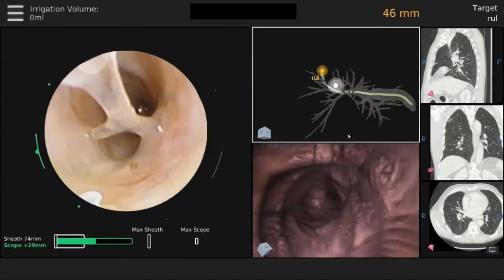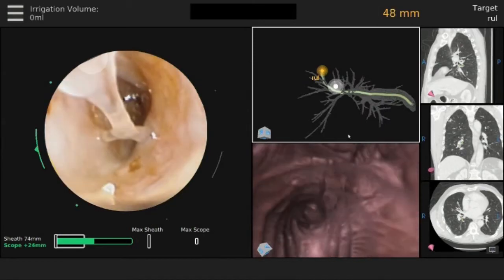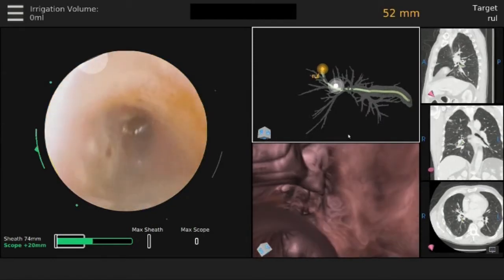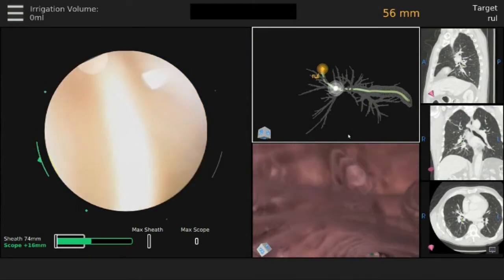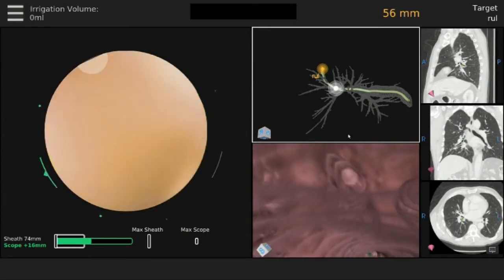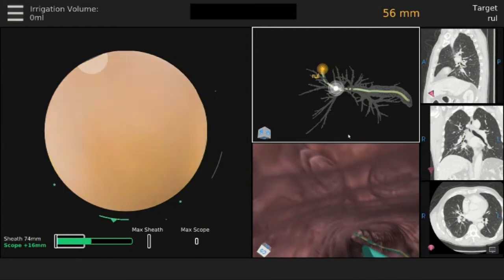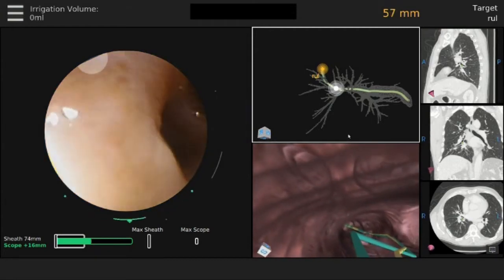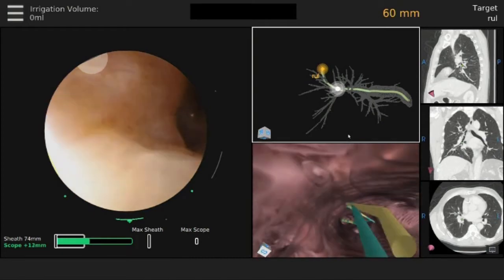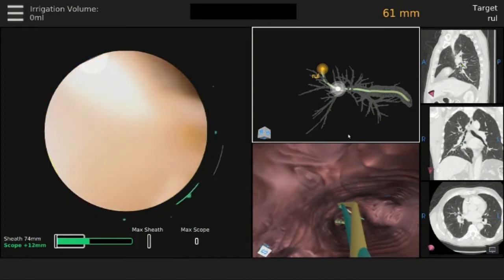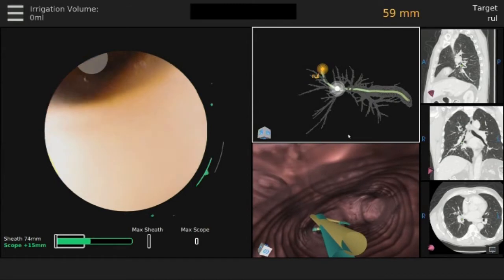There is the ability to transition between the central airway navigation views and the peripheral navigation views during the course of the procedure. The pathway is depicted on the virtual bronchoscopic view, as well as its correspondence to the direct bronchoscopic view.